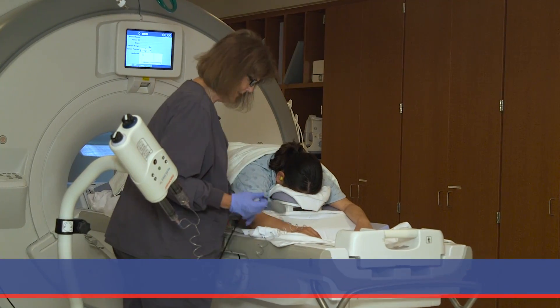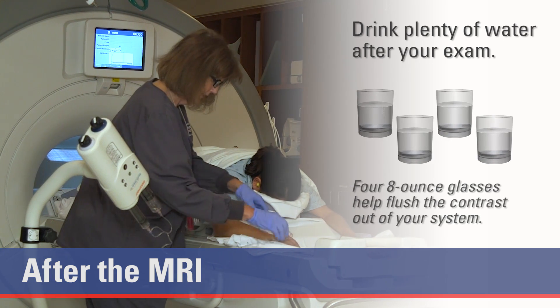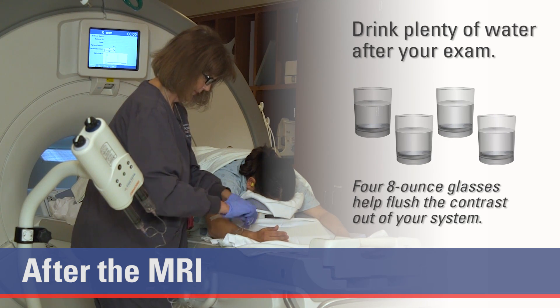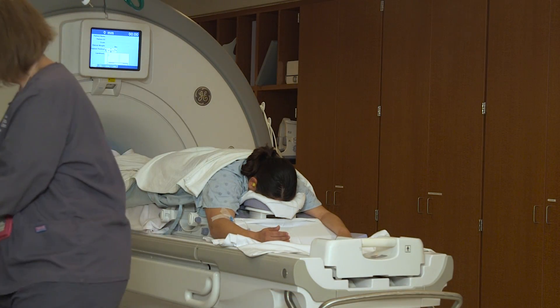Once the MRI is complete, your IV will be removed. Drink plenty of water after your exam. Four 8-ounce glasses help flush the contrast out of your system. You can ask about your results at your next doctor's visit.